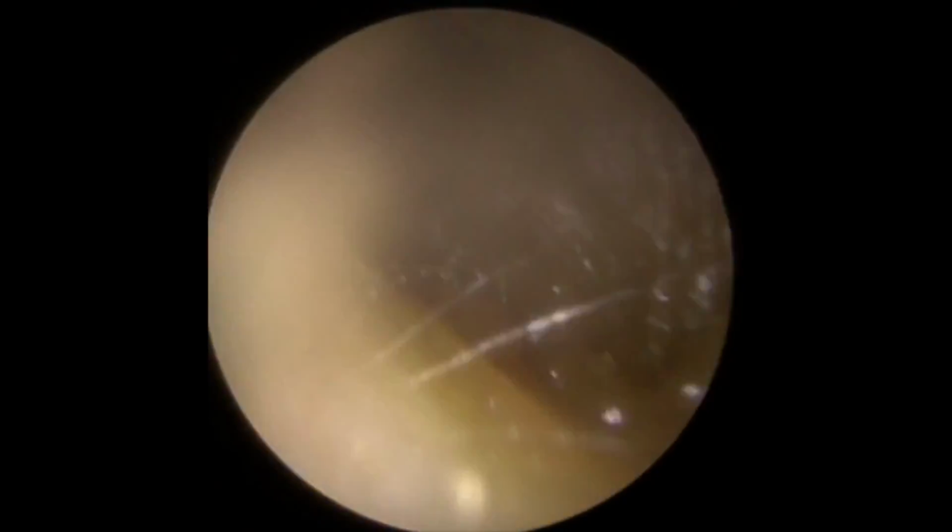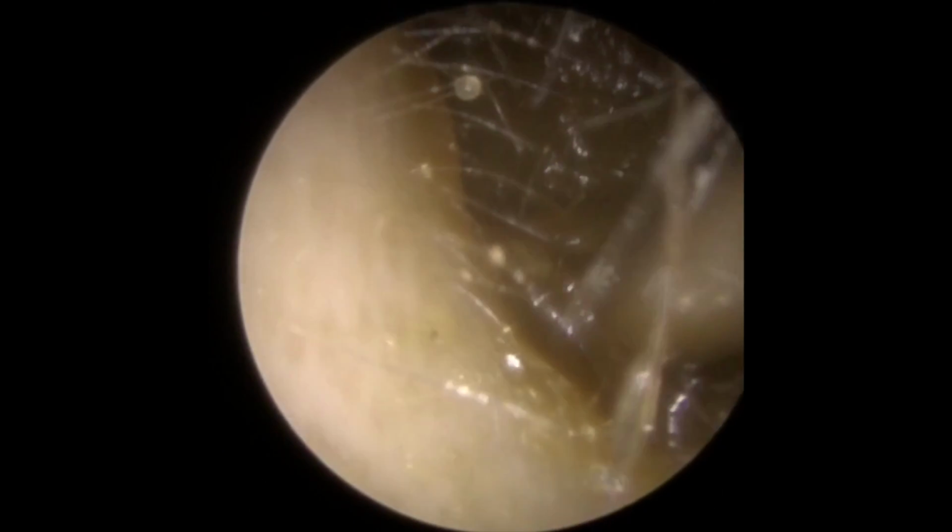So we're just working, this is the other side now, so the same patient but the second ear. Very similar story on this side, so you can see this very soft, sticky type of wax in this side as well. So we're going to use the same technique as on the other side. We're going to lift first of all from the base of the canal.